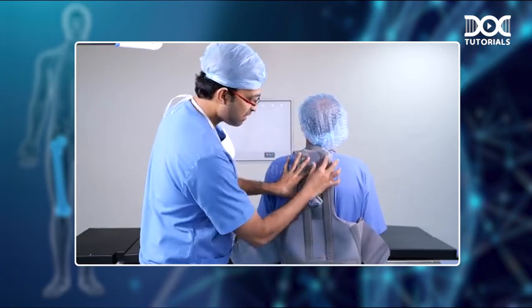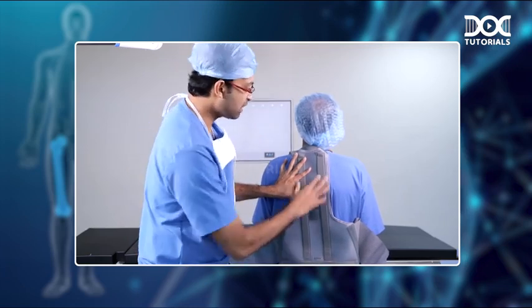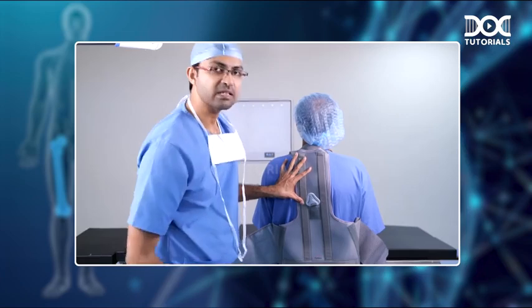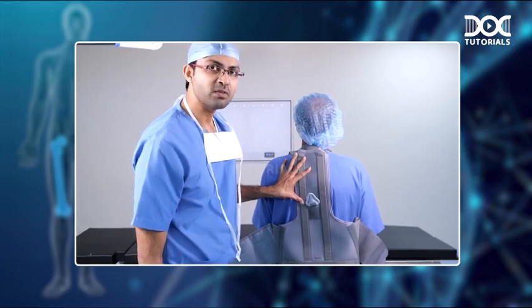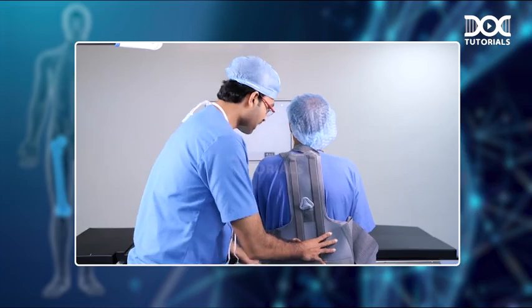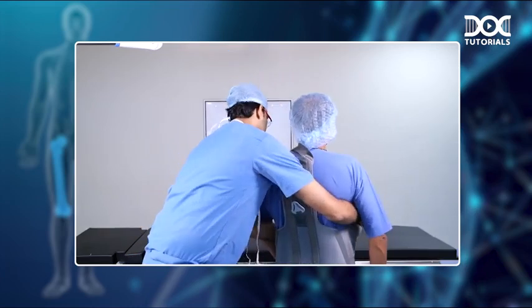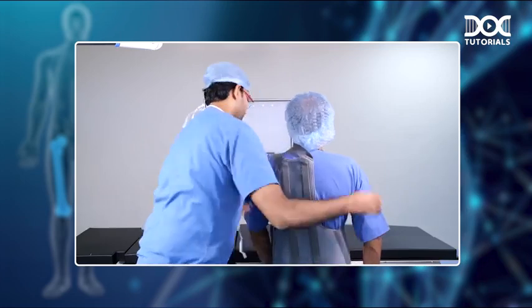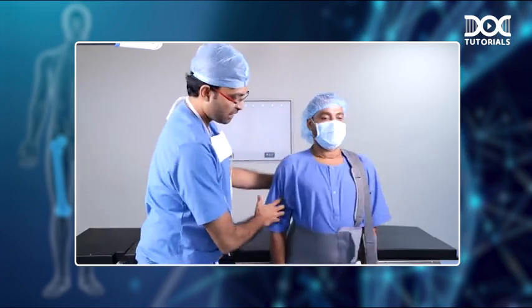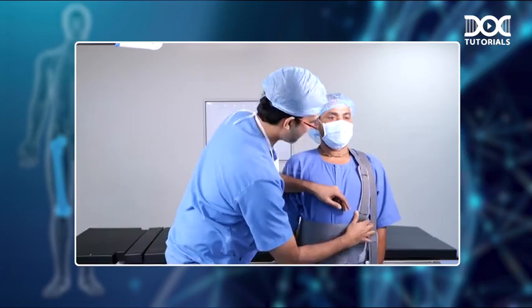And this metal rod is actually pre-bent, so it will correspond to the normal lordosis and kyphotic curvatures of the spine. So it is quite easy for you. Once you do that, you strap the abdominal straps to the front like this. Now you can see that I have strapped the abdominal straps to the front.